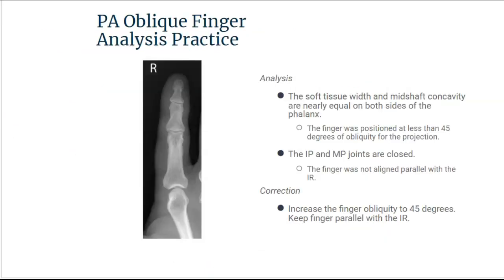In this practice analysis for the PA oblique finger, the image looks kind of like a PA because the soft tissue on both sides of the phalanx appears nearly equal. This tells you the finger is insufficiently rotated. To correct this, we need to increase the degree of finger oblique to 45 degrees. Also, the interphalangeal and metacarpophalangeal joints are closed — we need to make sure the finger is aligned parallel with the IR to get those joints open.